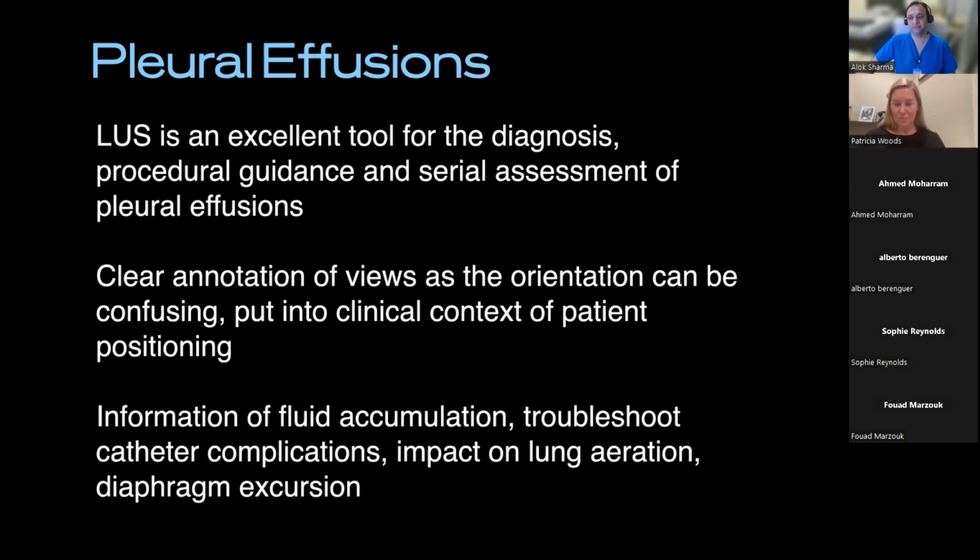Okay, some authors just multiply the lateral measurement by 10 or by 20. I don't know if we can be sure about that measurement, or we don't have data. Yeah, think about the chest shape. I think it's not perfect science, is it? It's not a cylinder and things, but it's hard. Like anything, you're just going to have to put it into clinical context, and it's a valuable tool that adds to information from the patient in front of you. If you've got a baby heaving and struggling away, unsupported or not supported enough, you're going to drain it. The same with air leak.